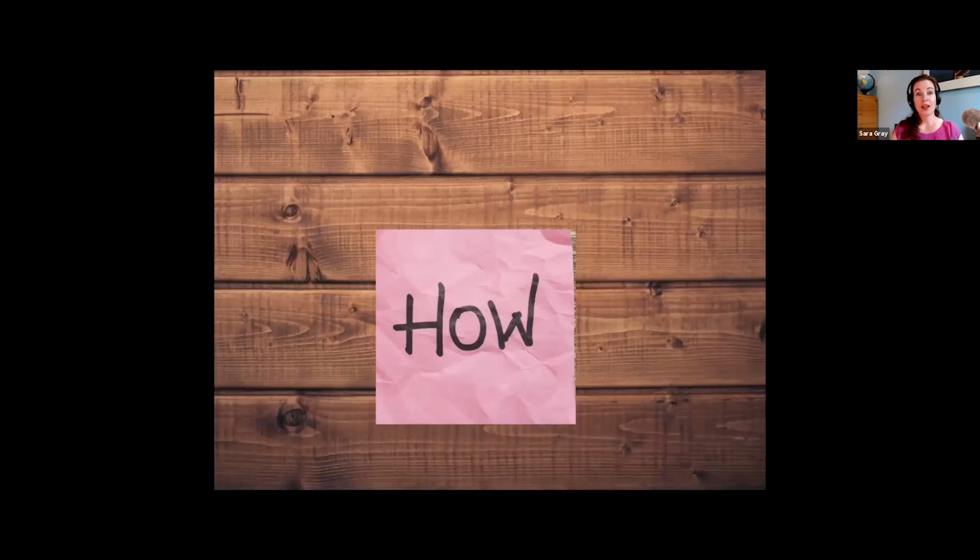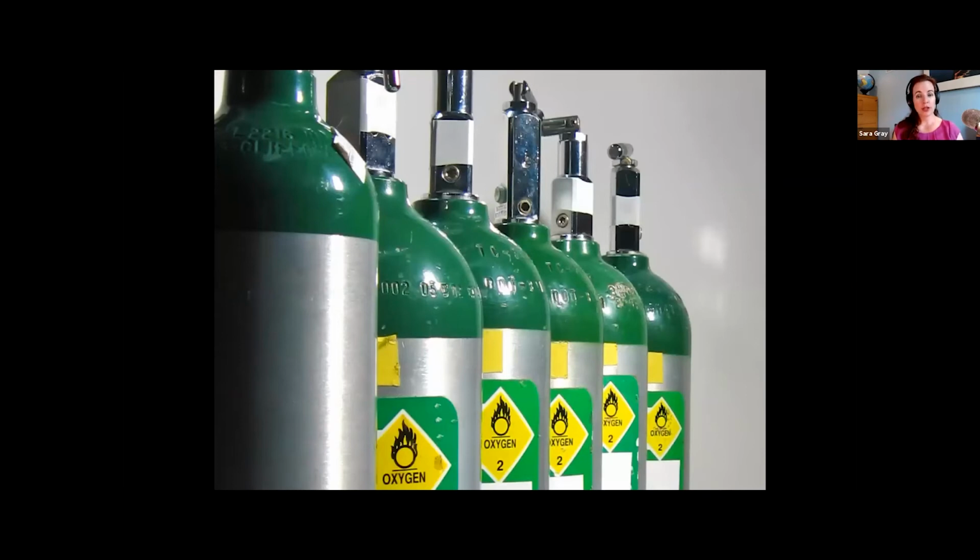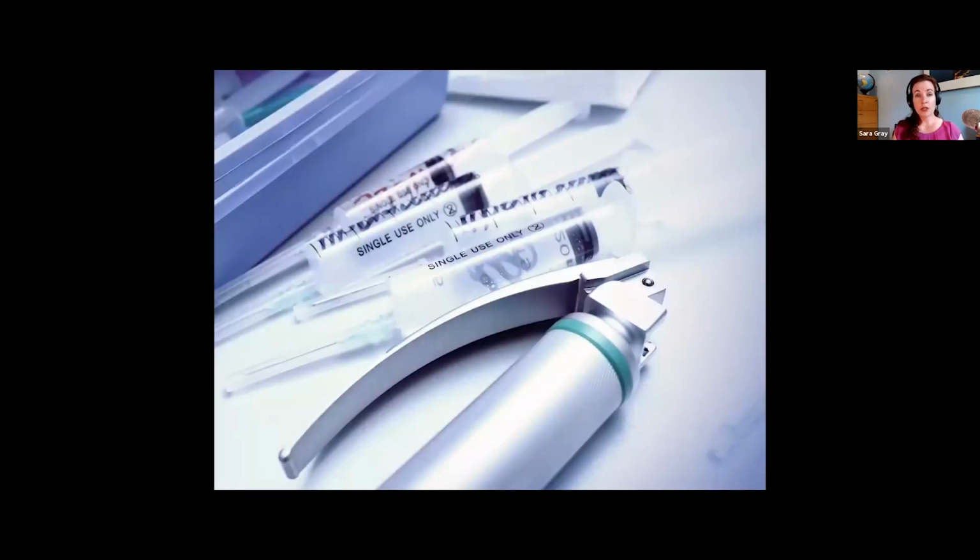Are you ready? So step number 1, pre-oxygenate your patient. This is pretty basic. We do this whenever we're going to do something to somebody's airway. You do want to have your intubation gear set up and near you somewhere in case this goes sideways. That is a rare complication, but it is always better to be safe rather than sorry.